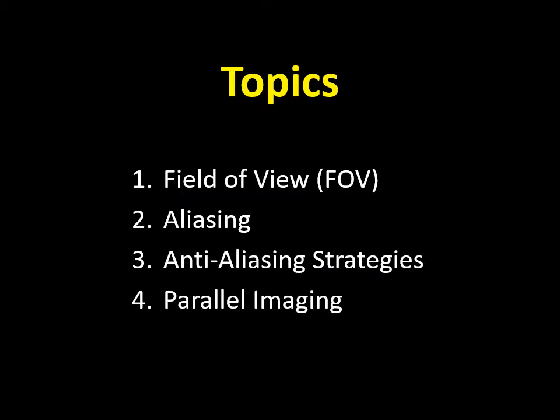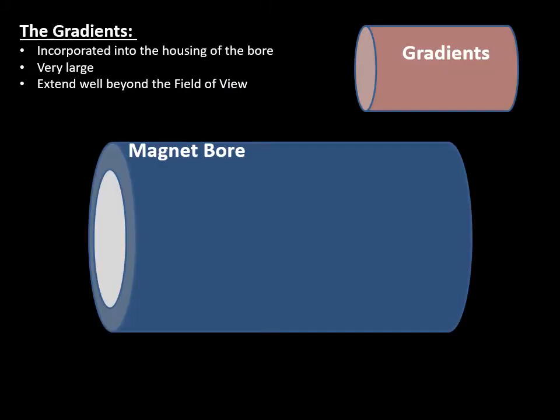This lecture will discuss field of view in greater detail, in particular how it relates to aliasing and anti-aliasing strategies, and that will lead to an introduction on parallel imaging. We are first going to start with a consideration of the gradient subsystem.